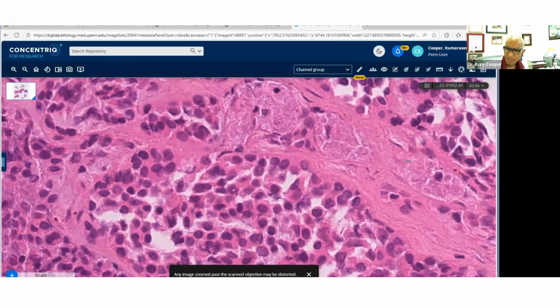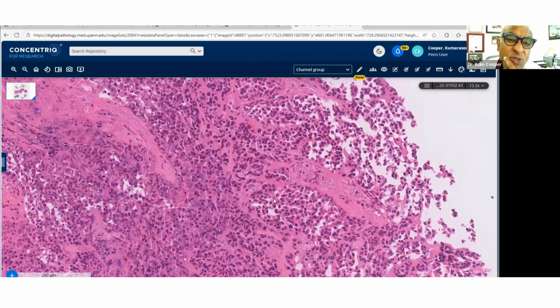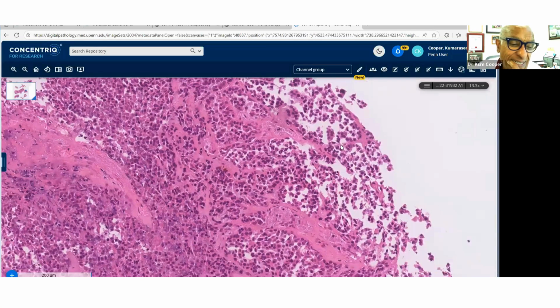And then for the PEComa, I know I only addressed actin and desmin. I did not say anything about the melanocytic markers, but we can do that as well. So we've got melanocytic markers cooking, we've got EWSR1 cooking, and we've got chordoid meningioma. That's a very good thought. So the chordoid meningioma looks like a chordoma, except it's a meningioma. And maybe some of these cells do look sort of chordoid-like with strands and nests.